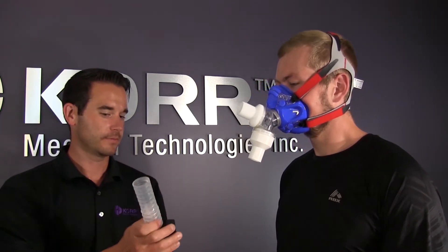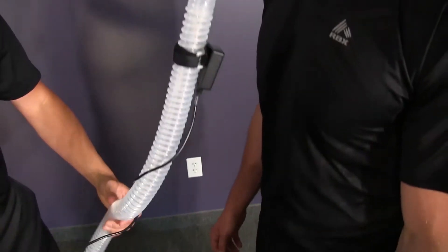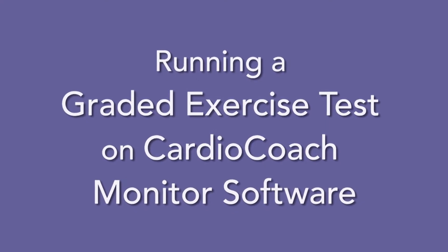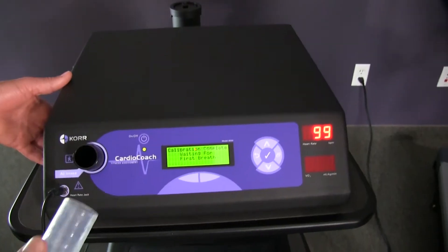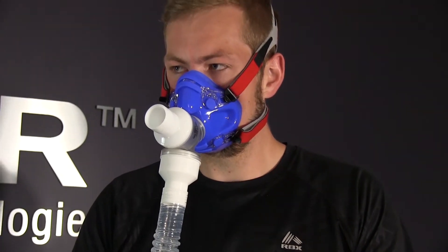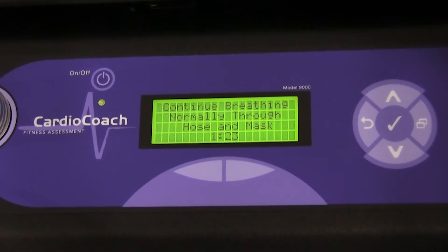Connect the VO2 hose to the valve. Cover the hose and have the client blow as you listen for any air escaping. If the hose has developed any holes over time, you will need to replace it to ensure accurate results — you may want to keep an extra hose on hand. Once the machine has calibrated and your client's mask is fitted, connect the VO2 hose to the air intake valve. Have your client relax and breathe normally through the mask and hose. Once the CardioCoach is filled with expired air and receiving a steady heart rate signal, it will begin to count down from 1 minute and 30 seconds.